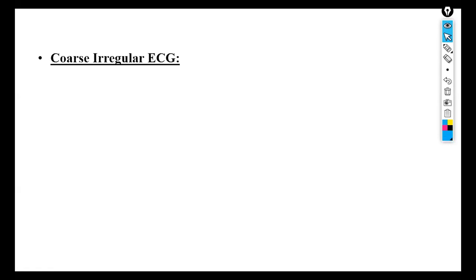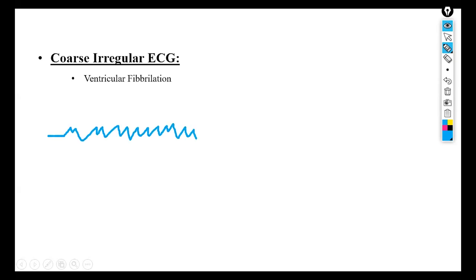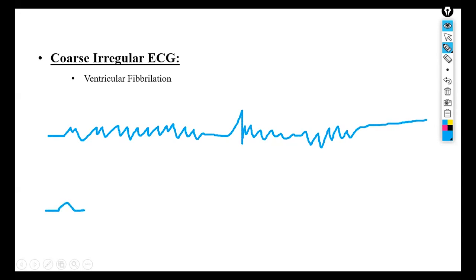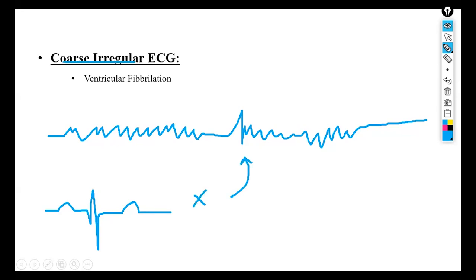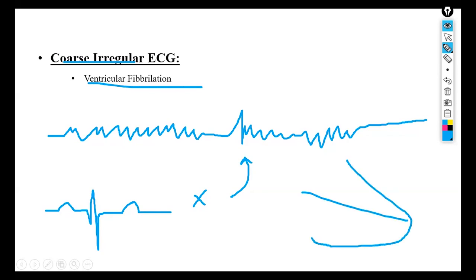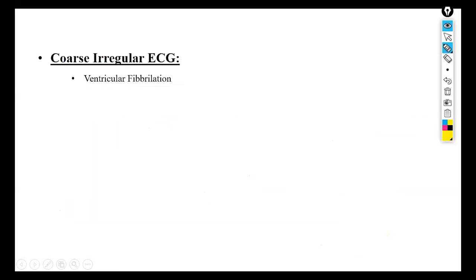Coarse irregular ECG is because of ventricular fibrillation. The normal ECG is replaced by a coarse, irregular waveform. In ventricular fibrillation there is no coordination, and the impulses spread throughout the heart without any control, resulting in this irregular ECG pattern.